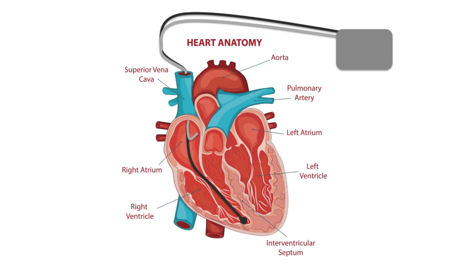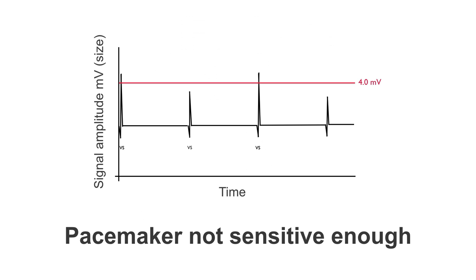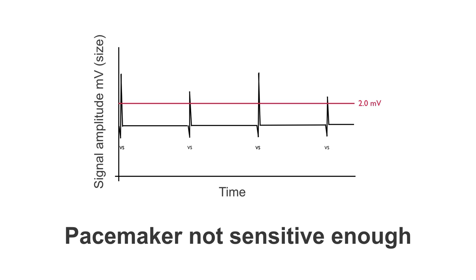So what is happening? Well, for whatever reason, the pacemaker is not sensing the ventricular activity. This is quite often because the ventricular signal has become too small in amplitude. Here we can see that the pacemaker's sensitivity is set at 4 millivolts, and therefore it is ignoring these ventricular events which are less than 4 millivolts in amplitude. If this was the case, we could resolve this by making the pacemaker more sensitive, and once more we are detecting all these ventricular events and normal service is resumed.